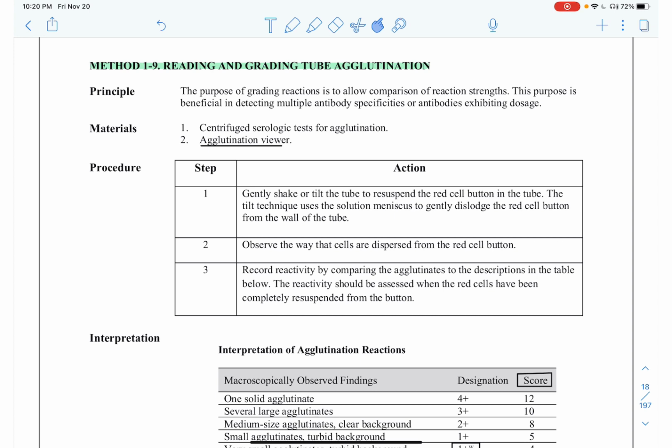Just a note on the word agglutination. You'll observe in some laboratories that they use the word precipitation to refer to clumping. However, in the blood bank, agglutination is a process that occurs if an antigen is mixed with its corresponding antibody, and we observe clumping macroscopically. So when I teach different individuals from different laboratories and they come into the reference lab, I always make sure to differentiate between precipitation and agglutination.